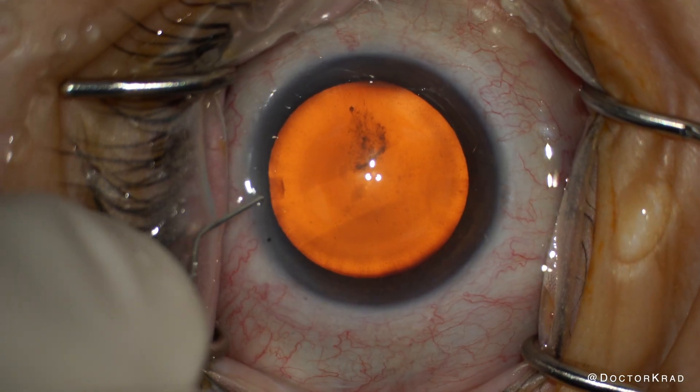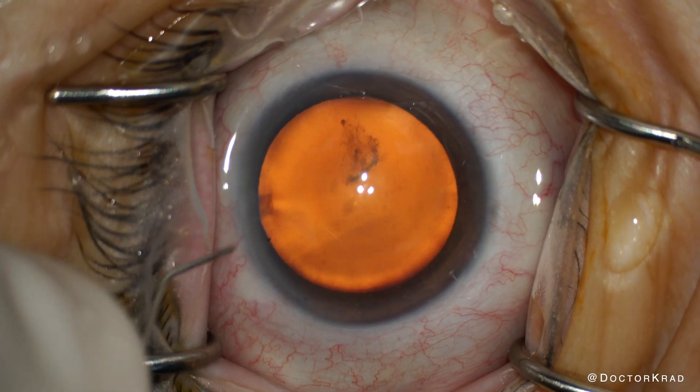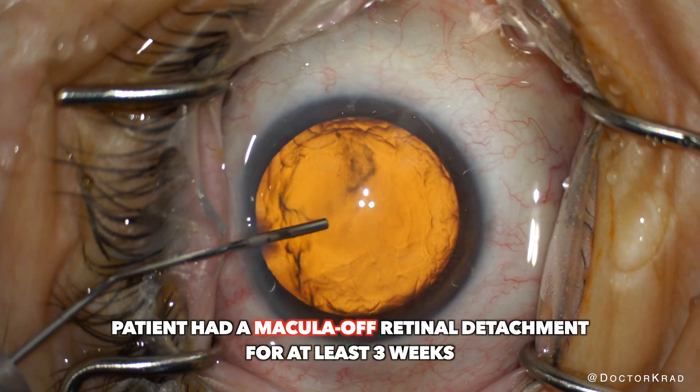We can easily remove the cataract to help the patient's vision, but will the vision be good enough for the patient? Spoiler alert — today's video doesn't have a happy ending, but I share it because it confronts the reality that some patients, unfortunately patients with retinal disease, face.